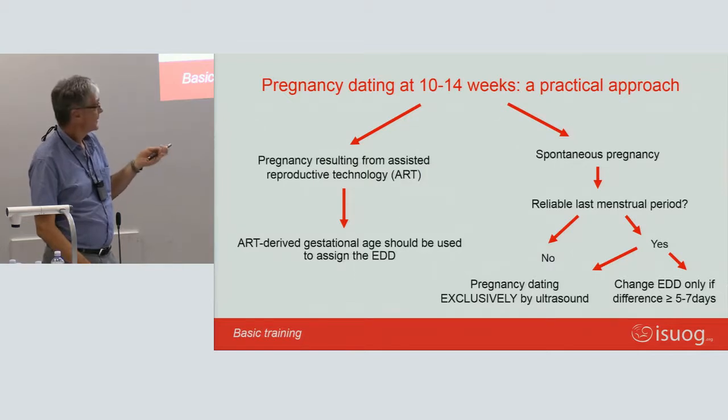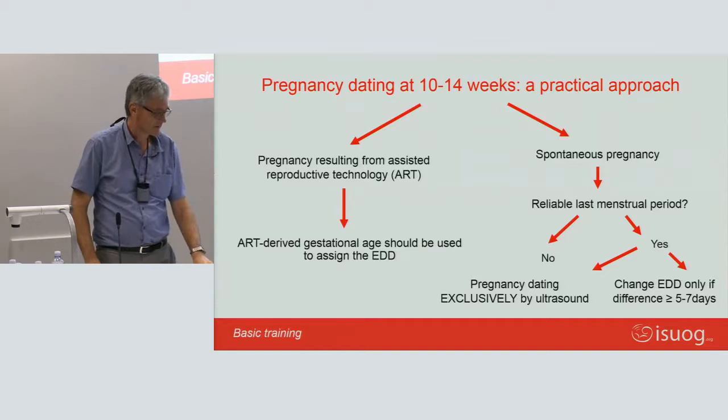ART, use the ART date. Menstrual, use the ultrasound date if it differs more than about 5 days.